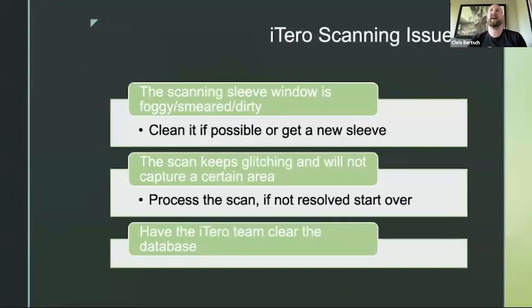A lot of people have been coming to me with issues they've been having with scanning. These are issues I've had in the past, and this is how I've addressed them. The biggest one is that if the scanner seems to be working and it's just not picking up, oftentimes the scanning sleeve, that little window, can be smeared or have a scratch in it. It's crazy how much of a difference it makes. I either clean it, but oftentimes I just put a new sleeve on, and then we're rocking and rolling.